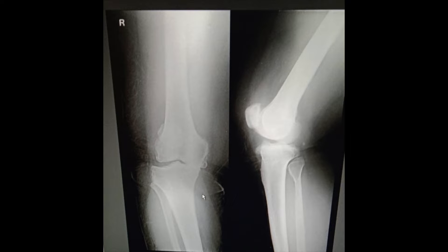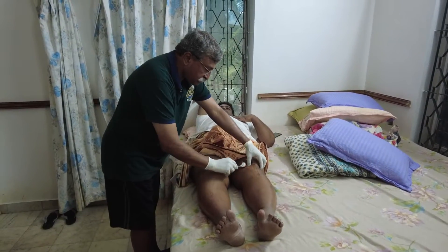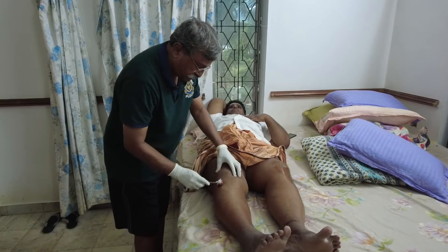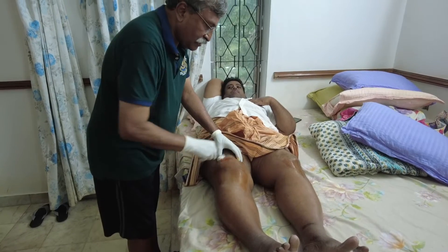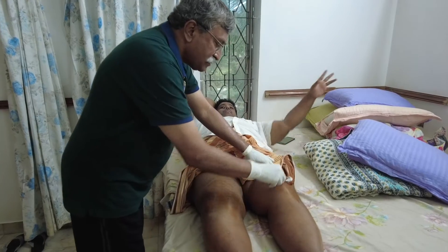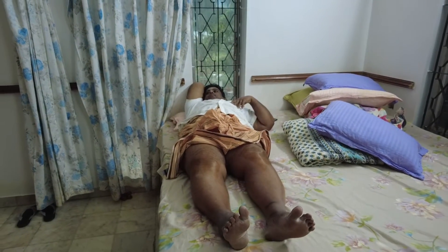He was unable to sit down or squat. He had come to my home rather than my clinic, and this is being done in my bedroom, where both knees are first cleaned for intra-articular visco supplementation along with ozone at 70 microgram concentration, 5 ml in each knee.